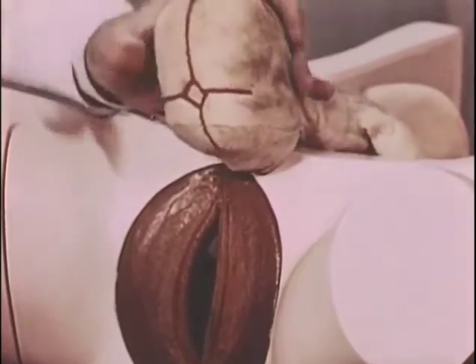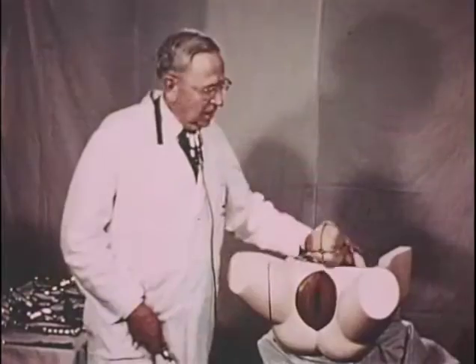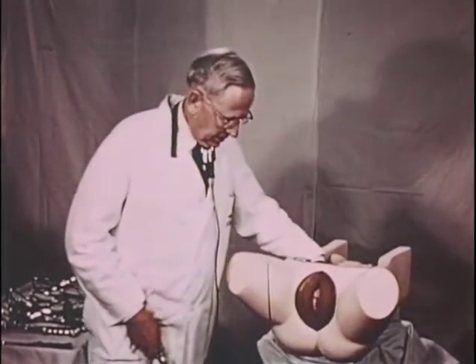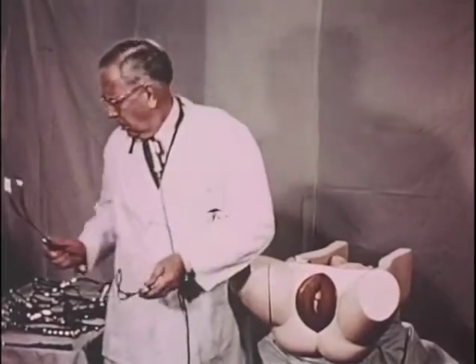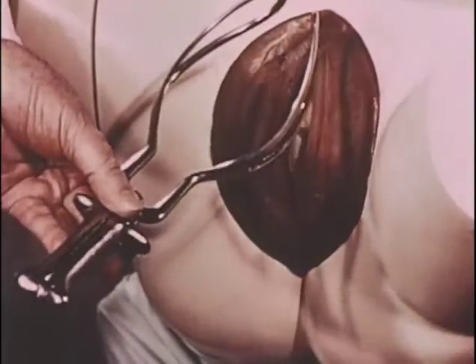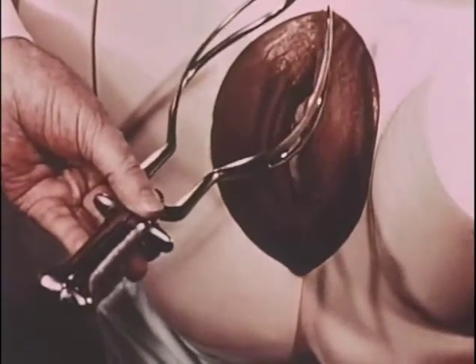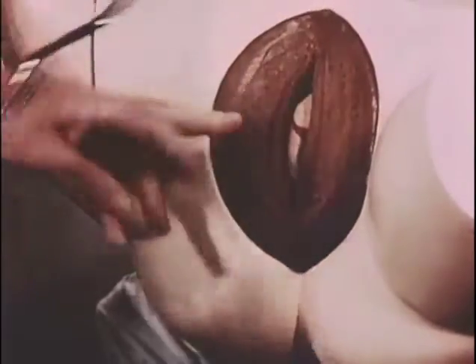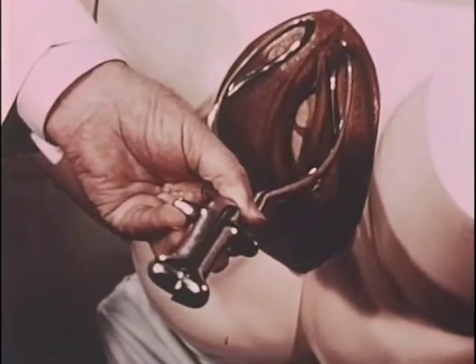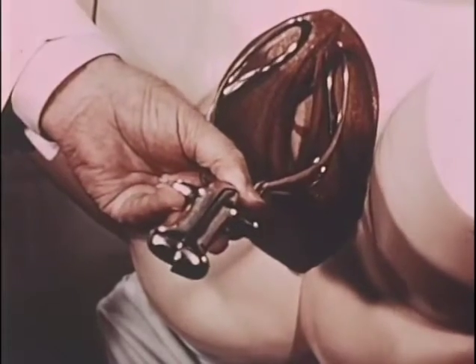So that we know that in all left-sided positions of the occiput, the left ear is always posterior. So we follow the technique of the posterior blade first application. Hold the instrument locked in front of the patient in the position in which it'll be after application. And we see our sagittal sutures in the good LOA oblique, and our instrument will be, when applied, in a position similar to this.